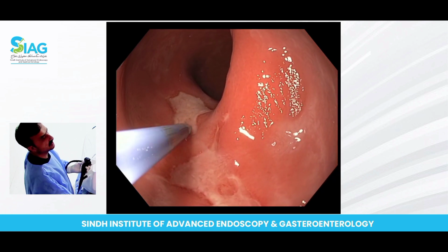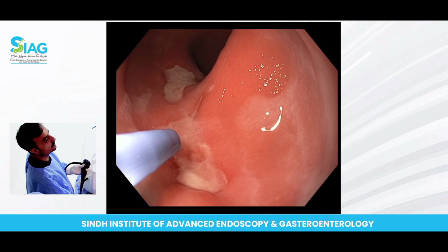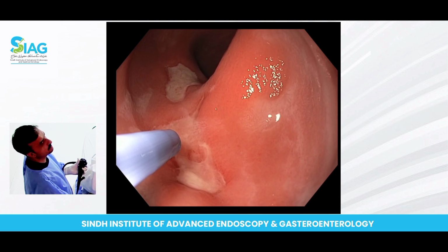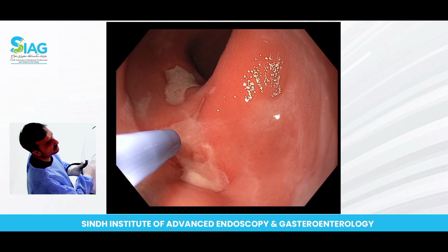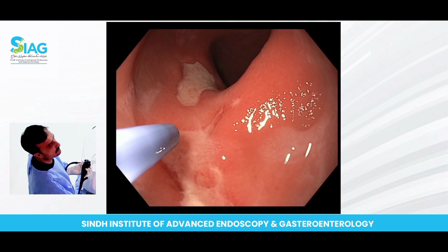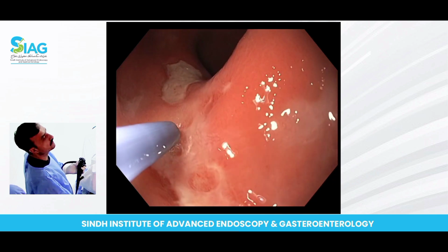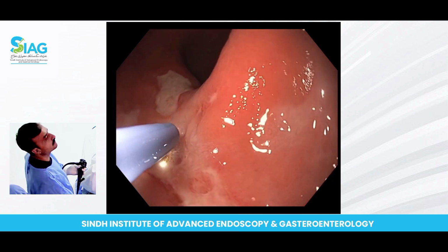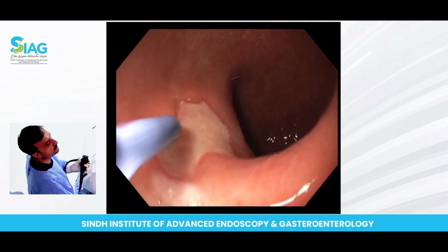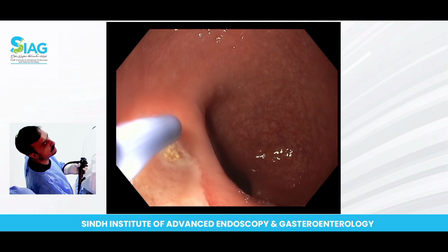As we know, there are currently some studies which suggest that along with medical therapy, with laxatives, high fiber diet, and toilet training, despite all these medical therapies, there is still a role of APC for the SRUS lesions. So we have currently done nearly 18 cases of SRUS patients with multiple sessions of APC. So today we are doing this patient's APC.